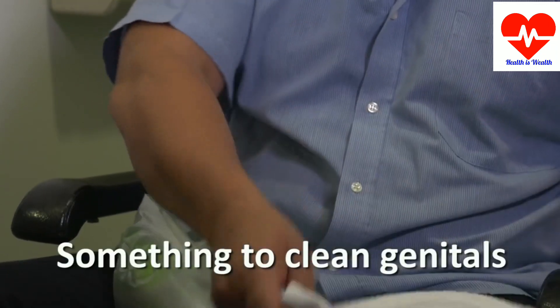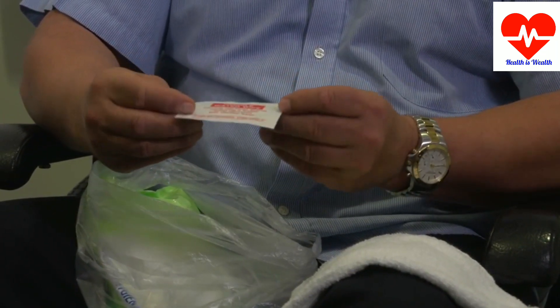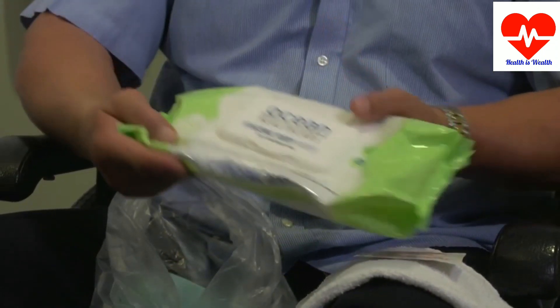Something to clean your genitals: water wipes, wet wipes, or a wet face washer without soap. You should wash your genitals with soap once a day, but not more often, as it destroys the healthy mucosa.